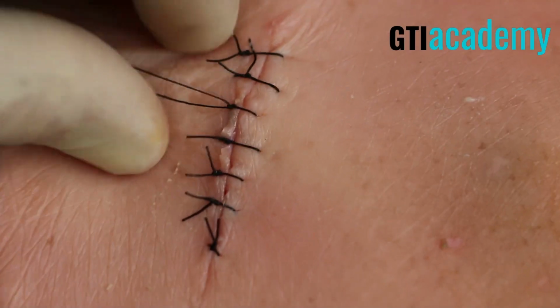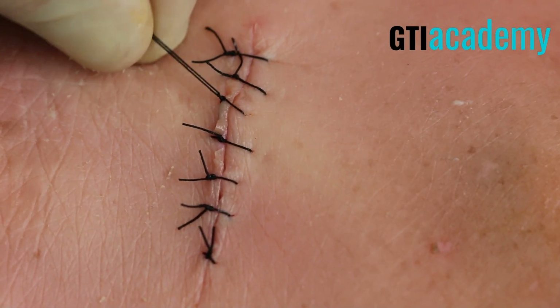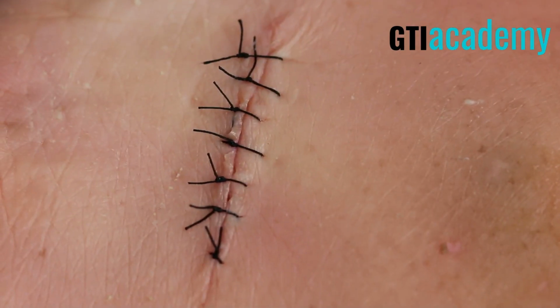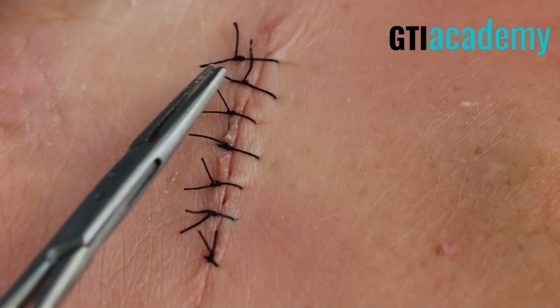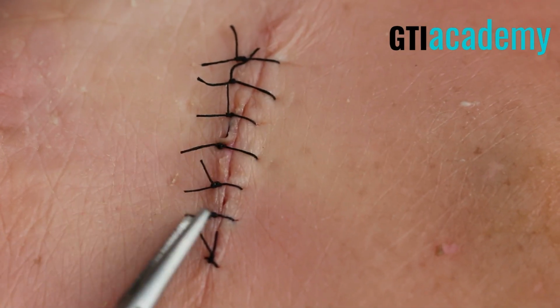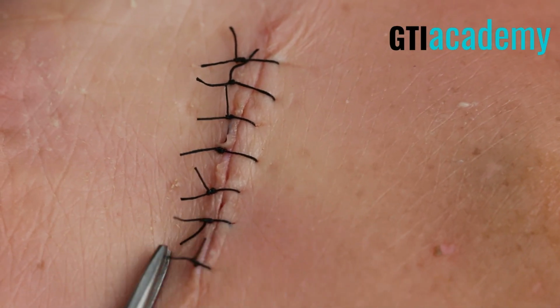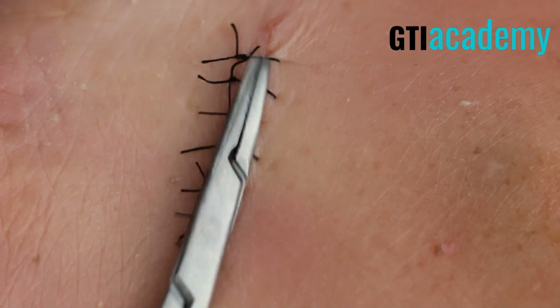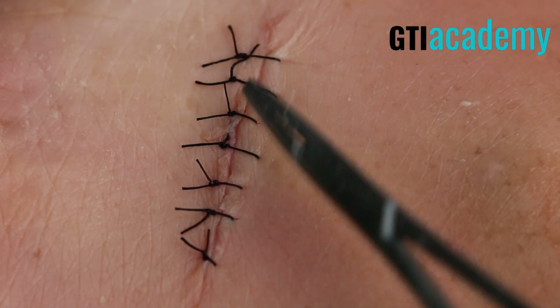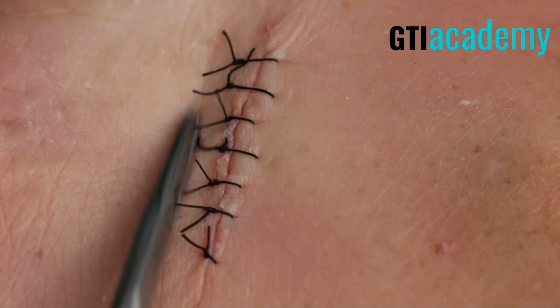Nice and approximated. Notice how equal the free ends on each of the individual sutures are, and also have all the knots tied on the end as well. All right, a little fine tuning here. I'm really looking for approximation of the wound, and the sutures all look very nice. All right, well, this completes the simple interrupted suture.